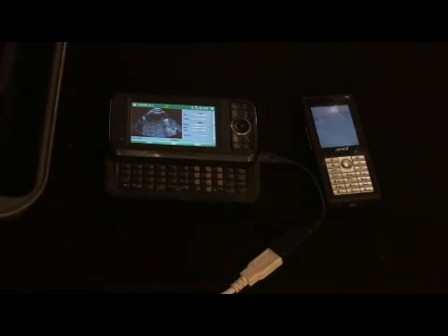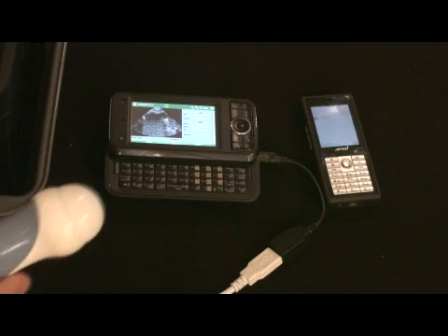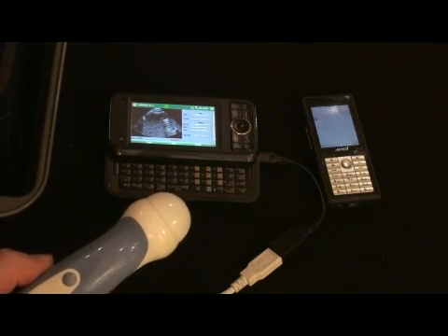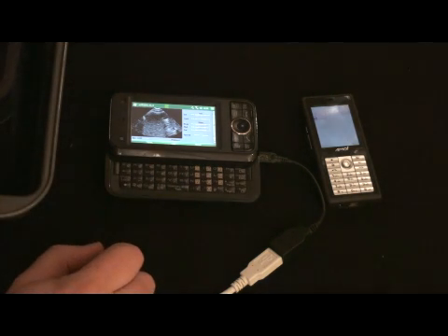We have full scanner control, just like we would on a laptop or desktop PC. These probes are used in diagnostic systems that have been available for a few years. We can adjust gain and imaging controls, and lookup table controls on the scanner for display.